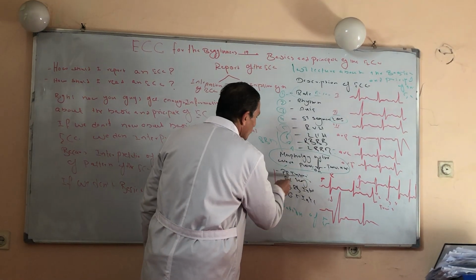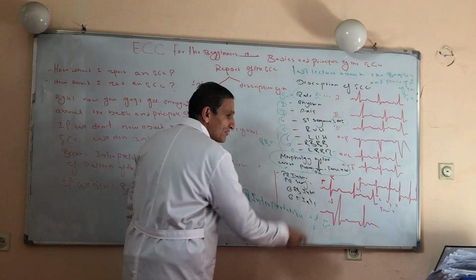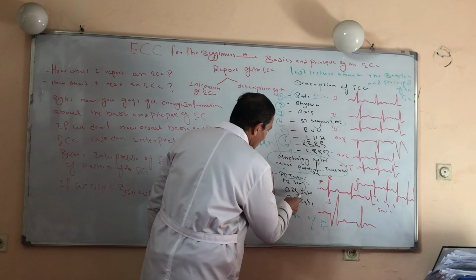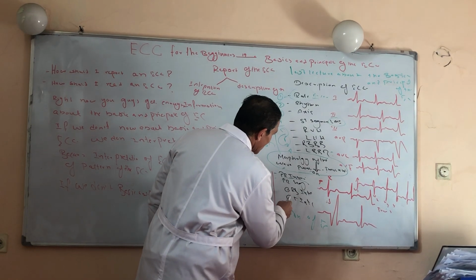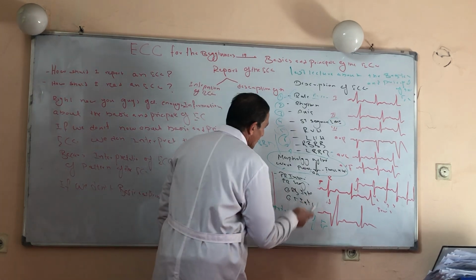In addition, we have got segments: PR segment, ST segment, and TP segment. Among these segments, which segment is very important? ST segment is very important. And finally, the T wave and QT interval.